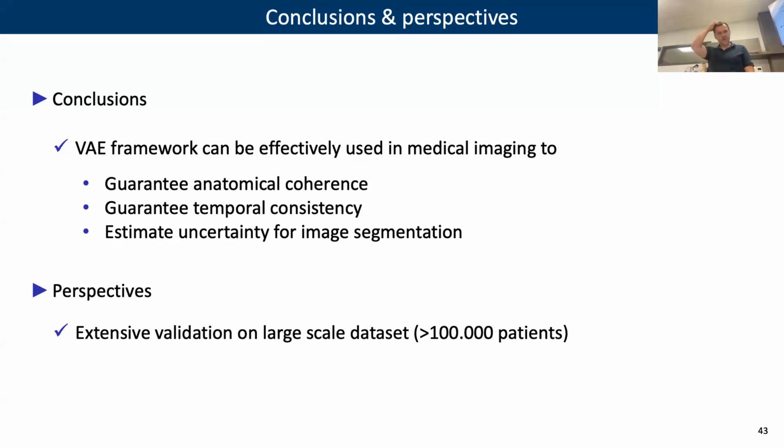We got access to 100,000 patients in terms of echocardiography, and we are currently applying this framework with more things like reinforcement learning with small human interaction, because of course you cannot check on this huge data set whether every segmentation that has been corrected is correct or not. So you have to make it automatic with as little human supervision as possible. And this is what our PhD students are working on.